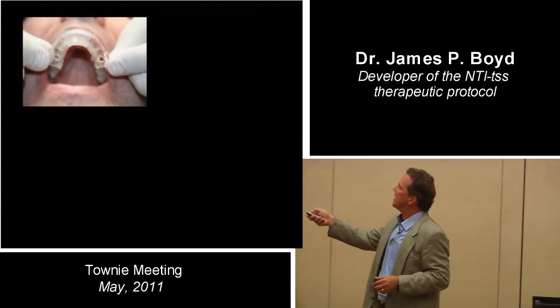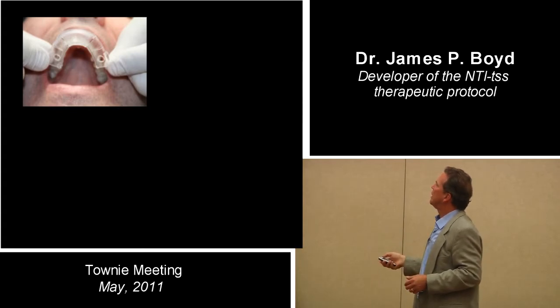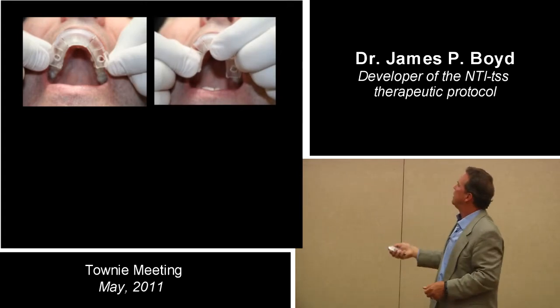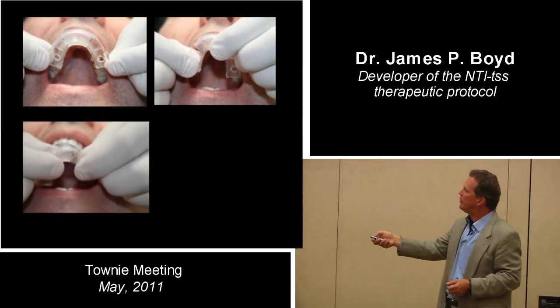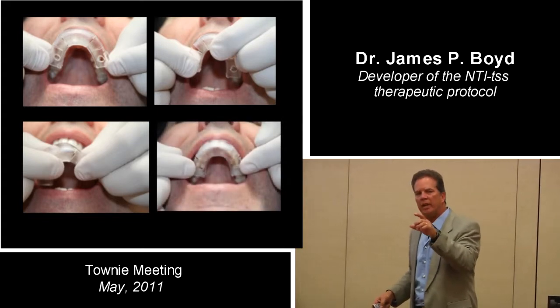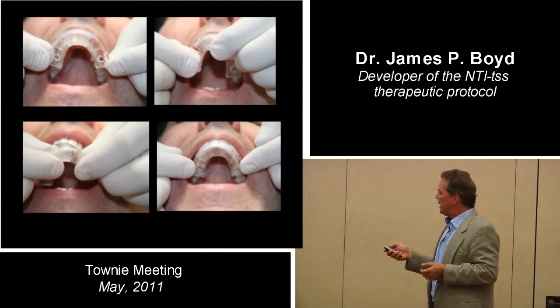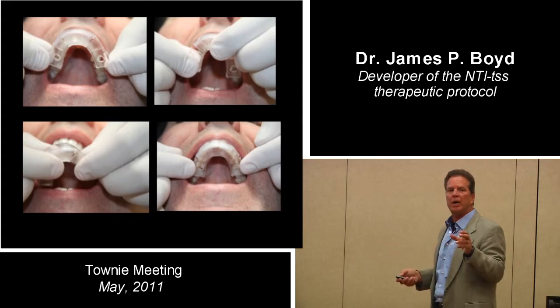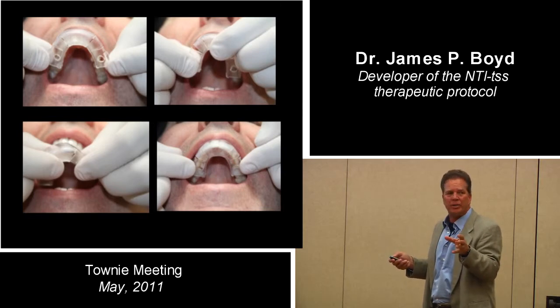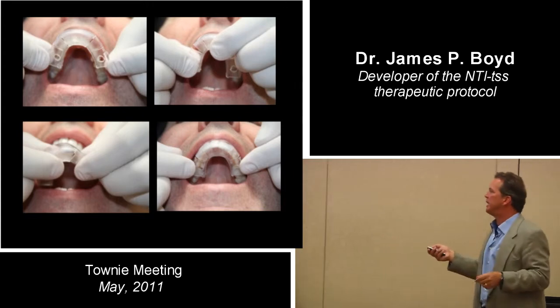Ignore those holes there for a second, but this guy's got a very narrow arch, and so I'm pinching in right here. And then I can narrow it by the back and bend that thing. And I can pinch it in there. And when we do these after lunch, the most important thing, and the thing I never spend enough time on, because I always make them on myself, I think it's going to work perfect, is getting the arch dimension just right, because it'll hold its shape. When it's too wide or too narrow and you bite sort of out of bounds off of the tray, it makes for a weird, bulky situation. So you got to just spend an extra 30 seconds just to get this thing just right.